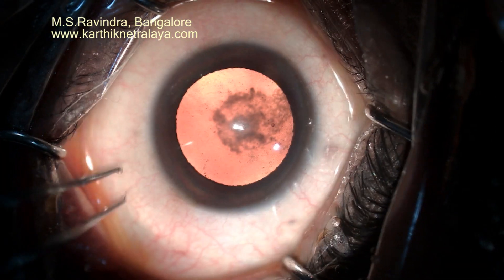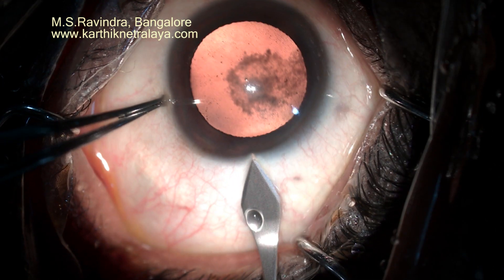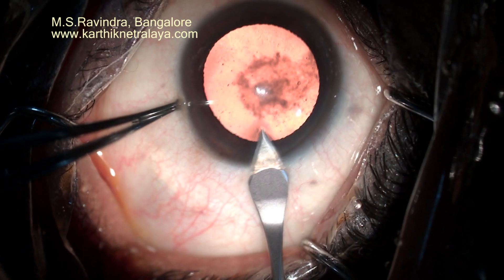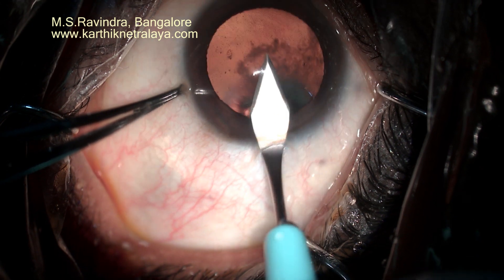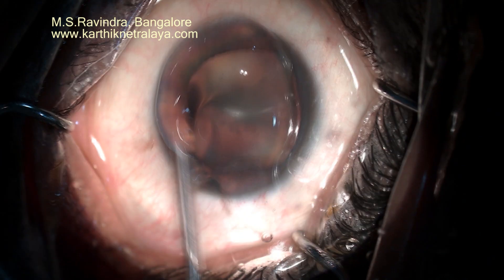A posterior subcapsular cataract. A keratome entry is made through the limbus and the cornea. Topical anesthesia. The anterior chamber is filled with viscoelastic.